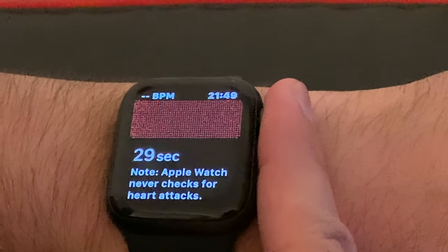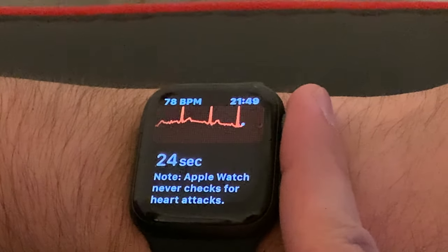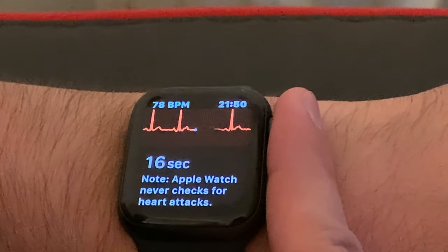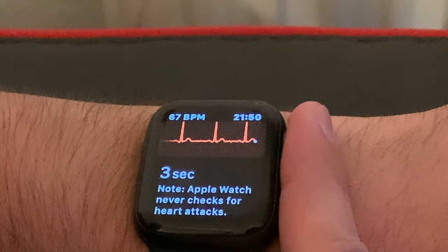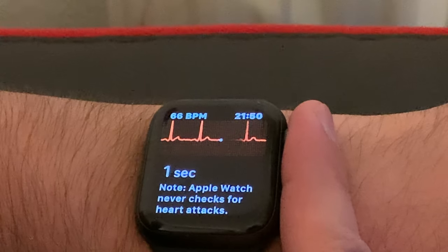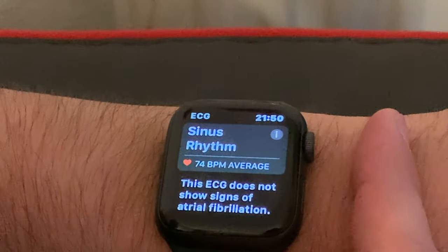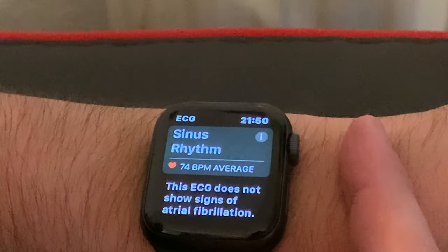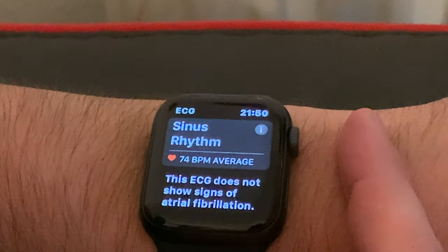The first thing you notice is that it gives you a 30-second countdown, and you've got to keep your finger on the digital crown for those 30 seconds. The video was sped up there because I didn't want you to wait. Now you can see the results of my ECG — I've got a sinus rhythm, beats per minute has come back as average, and everything shows up as okay.